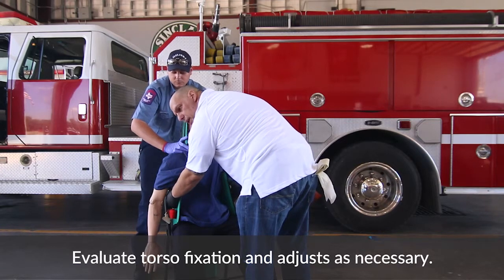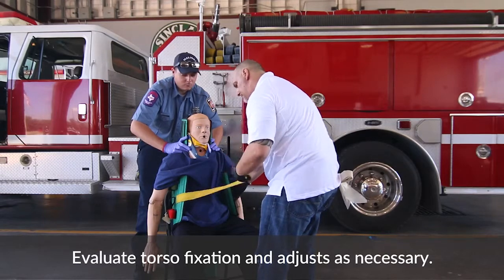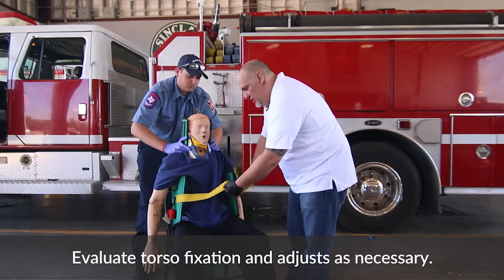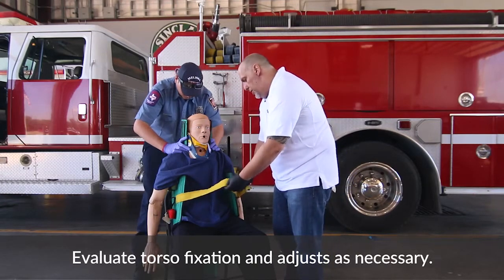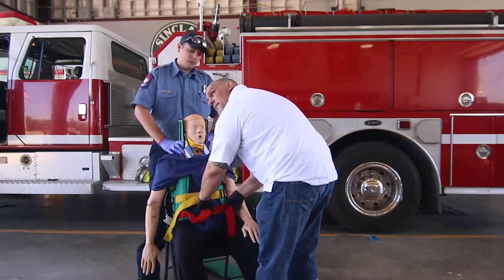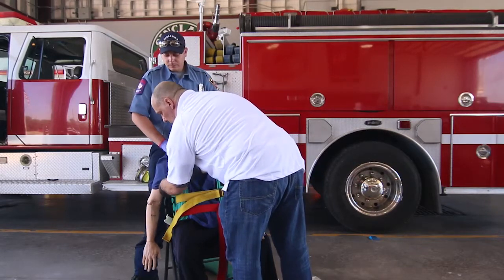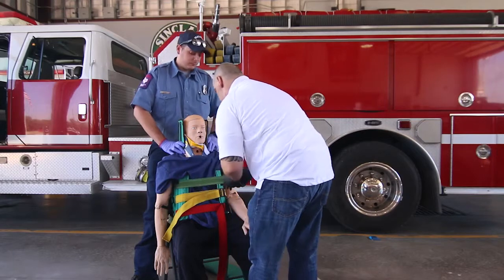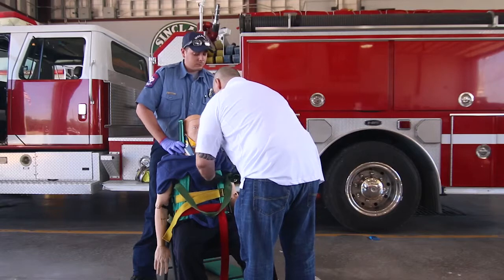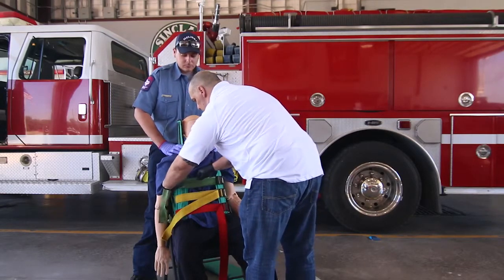Next, you want to use your middle strap — your torso strap — and secure that. As you go to tighten this, it's very easy to just pull and tighten it. But you don't want to jerk the device around. The way to do it is to feed the strap through and then pull rather than jerking. Make sure that it's snug. Ask the patient if they're having any difficulty breathing and make sure they're doing okay.